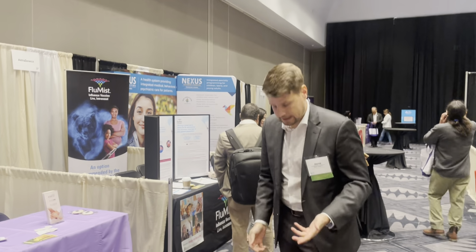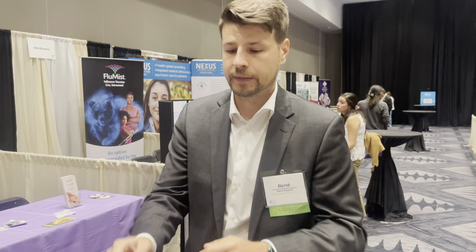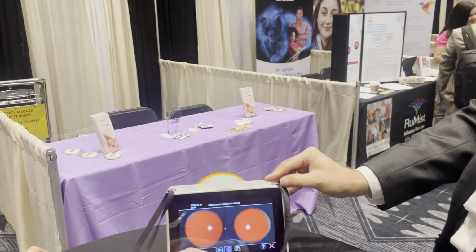And this is what you're looking for. So at some point, you will also know that this is the perfect distance, just from experience. Right? And then it's just about this and not about this. Because this is also what many people do. A lot. They start here, and when I'm like, okay, now please come closer, they will be like, take a step. Way too far. We also tell people, stand like this, so you just rock. After some time, they will know their distance, and then that rocking is enough. Reflex looks good.